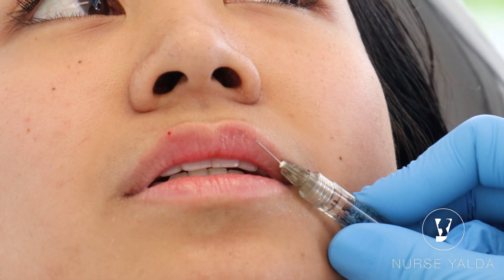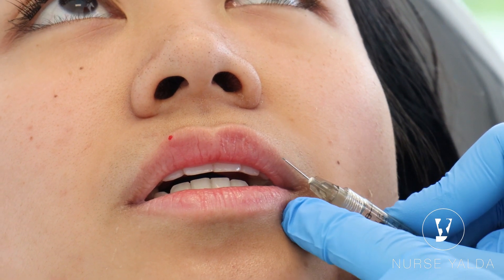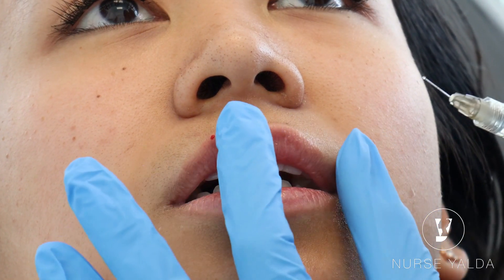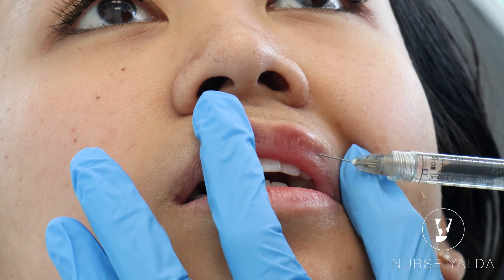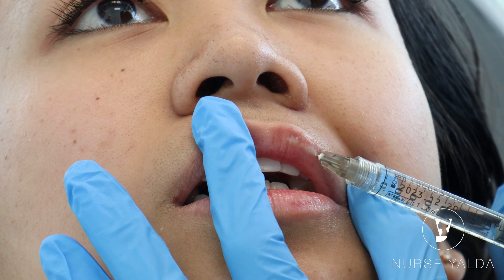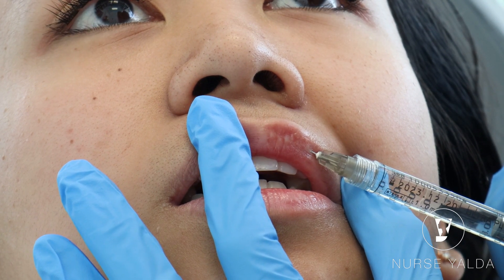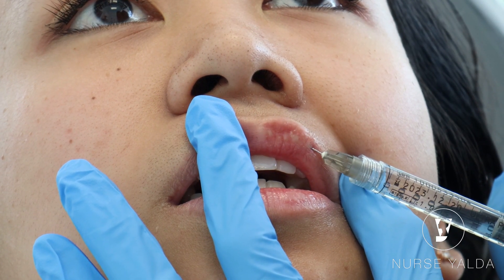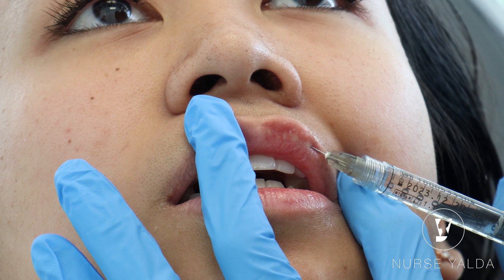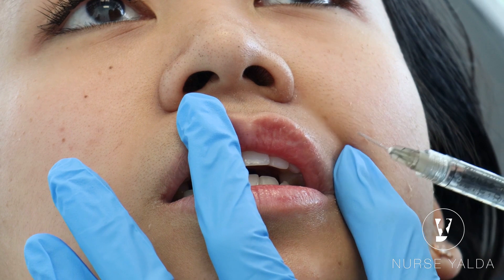Remember, from this area — if this is her lip — you give her volume, so you can start from here. Do you see where your entry point will be? Somewhere here. With your non-dominant finger like that, make sure you stay in the center. That's great. As you retrograde, make sure you give her product nice and slow.